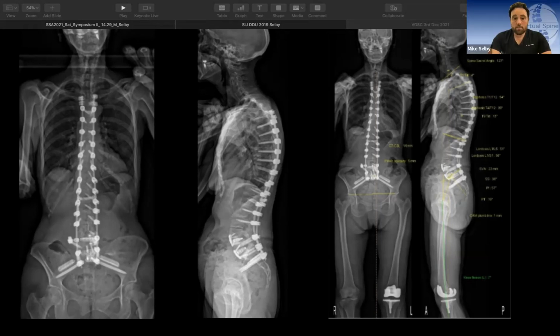It is. And it's because I suppose I haven't had a huge number loosen to a point where they're symptomatic. I've probably revised 3 from between 5 and 8 years ago in the past year or so. So it's not a huge volume, but it's enough that I've become more comfortable doing this bedrock technique. After the first couple of times you've done it, it probably adds 10 minutes total to the procedure, particularly if you use navigation. So to me, 10 minutes now to save an operation down the track is worthwhile. But I know not everyone feels that way.